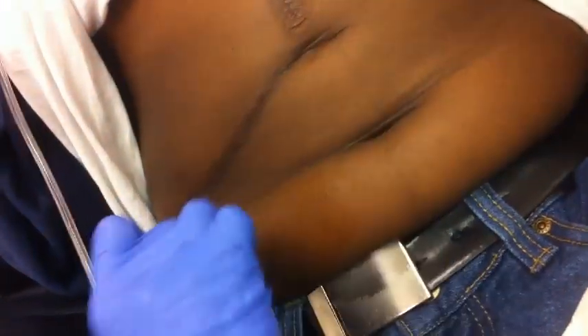The needle's really small. I'm hoping that it shouldn't hurt at all. I will give you some cold spray, just to make it real simple. Good to meet you today. Is it Janet? Janet.